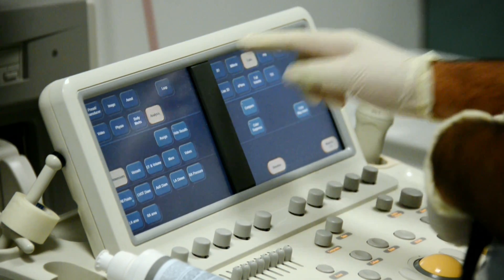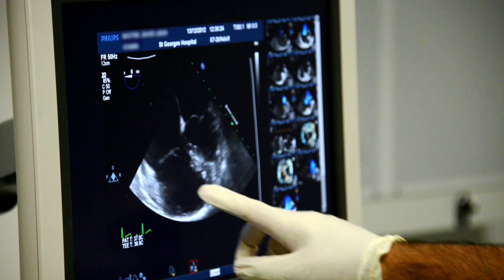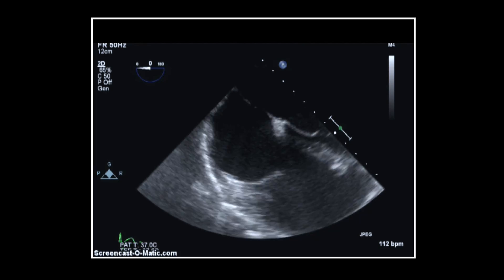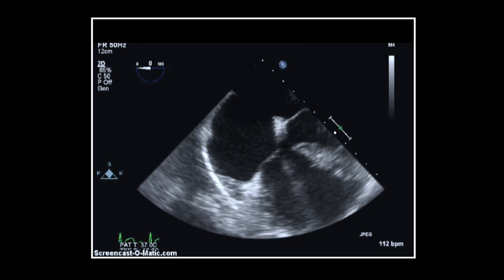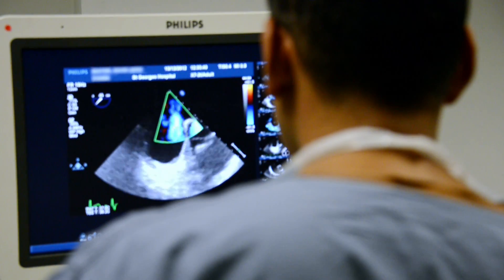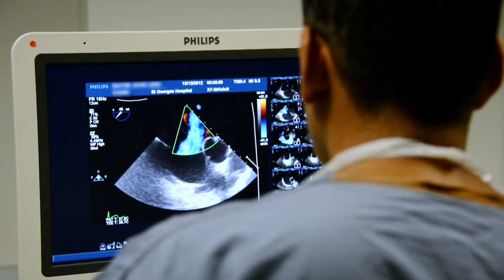These pictures allow me to see the back of the heart in great detail. In particular I can see the structure that I was concerned about, and I would not be able to see exactly how big this hole was, and also exactly where it was, without doing the trans-oesophageal echo. David, I can see the hole already, and I'm just going to take a look at that bit first.